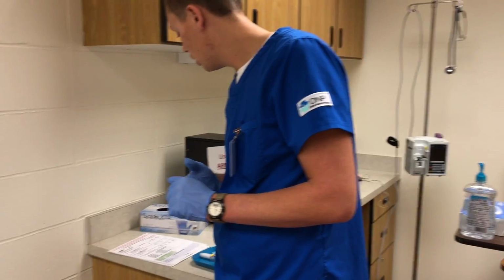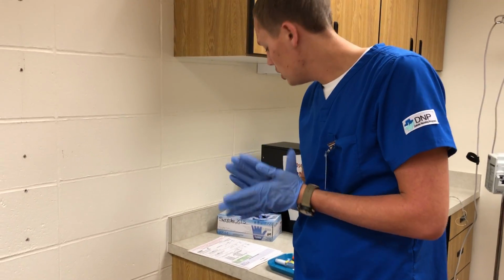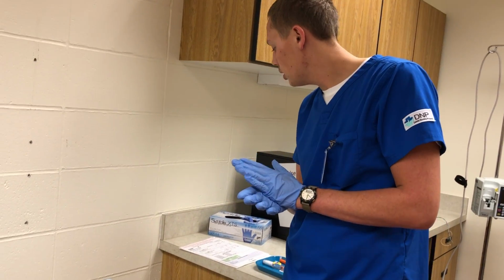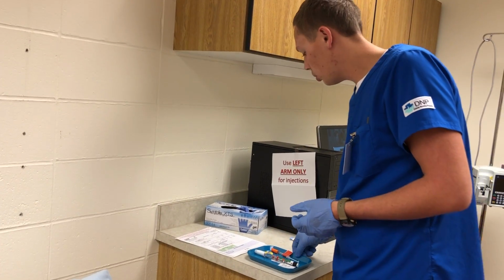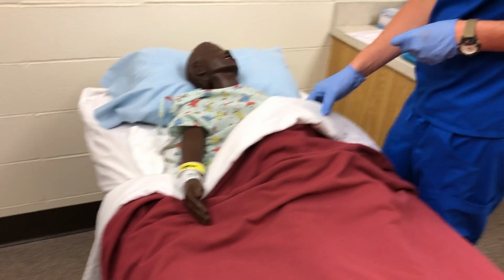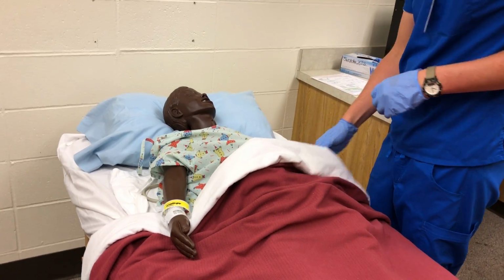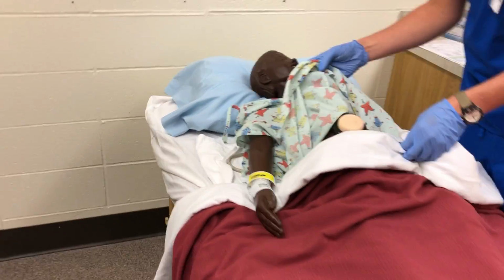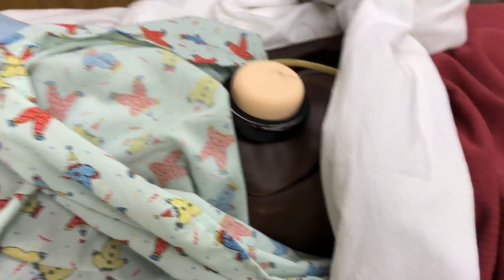So where do you usually take your shots at, Shirley? In your abdomen? Okay, perfect. So we'll do that there, but we'll just make sure to move sites just to make sure that it doesn't get any tissue breakdown, okay? Okay, so we're gonna pull that back and expose the abdomen, and we're gonna clean the first site.